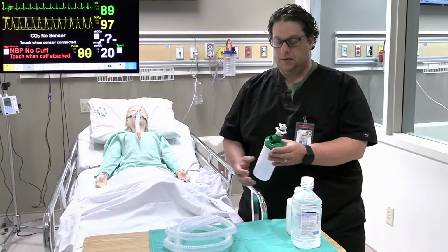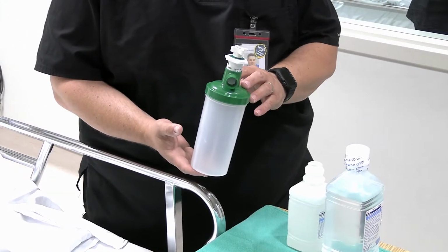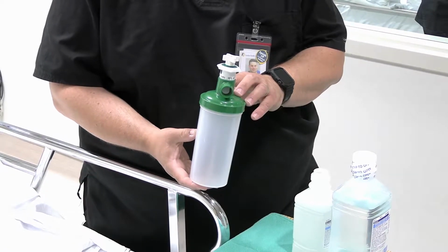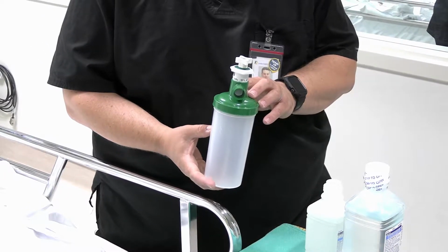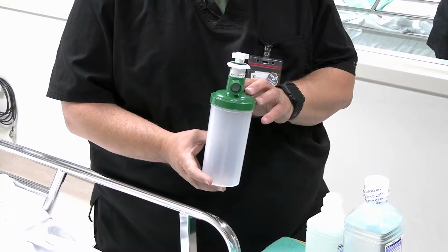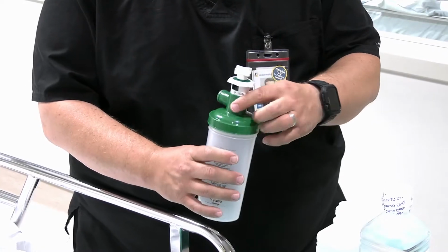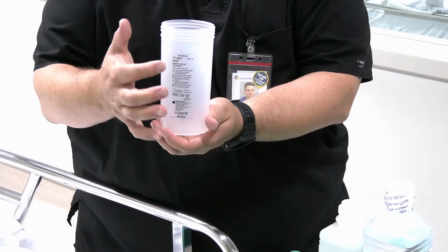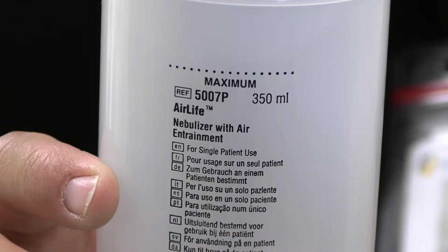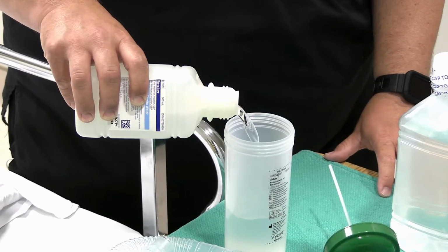Because we're on the 50% Venti, it's recommended to use the large volume nebulizer here. This one here, even though it's graduated up to 100% FiO2, we find the accuracy is not as good beyond 50%. So we recommend this device be used for 50% or lower for your FiO2 needs. Okay, so I'm just going to remove the lid here. And we have our fill bottle here, and you can see there's a max fill line there for putting sterile or distilled water in. So I'm going to fill this with sterile water or distilled sterile water.